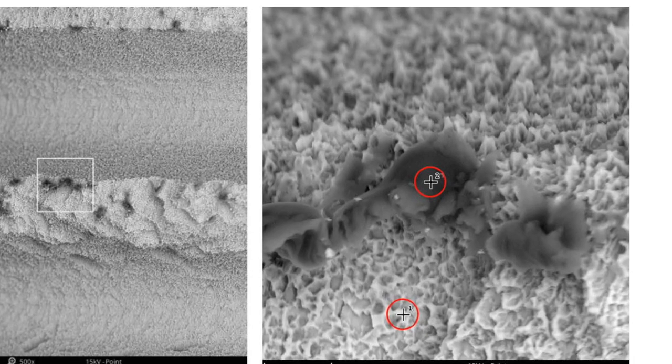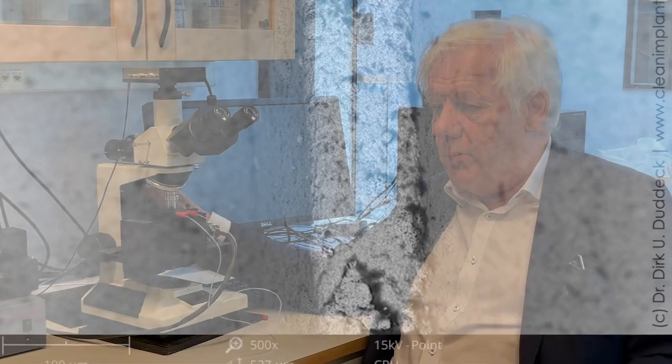I fear so. I've seen quite a few actually of the images you have produced from these implants. And in the beginning, I must admit, I was astonished that they could sell some of those implants to customers that they do sell. And I fear that this may be one of the reasons that we have overlooked in the past, that implant impurities that haven't been cleaned away can pose a problem. We don't know precisely today. We don't have any precise levels of what human beings can tolerate or not, but I would certainly prefer things to be clean compared to having to find out where the borderlines are of dangers.